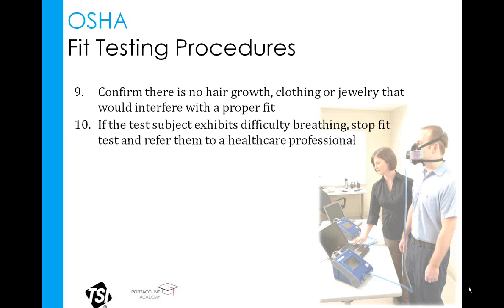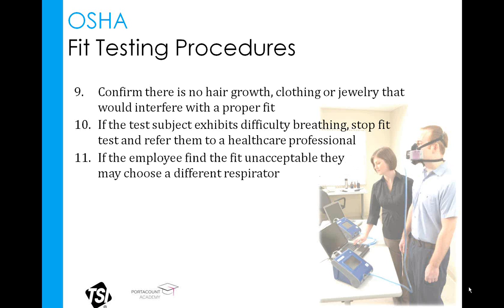Step 10, again, should really be considered during this entire process. Obviously, if the person is having difficulty breathing, then there may be some health issues that need to be addressed. Step 11, again, goes back to comfort, something that OSHA stresses as well. Even if the employee were to finish all 14 steps, including the fit test, and pass the fit test successfully, and in the end find that the mask is too uncomfortable to wear, then a new respirator and a new fit test are required.